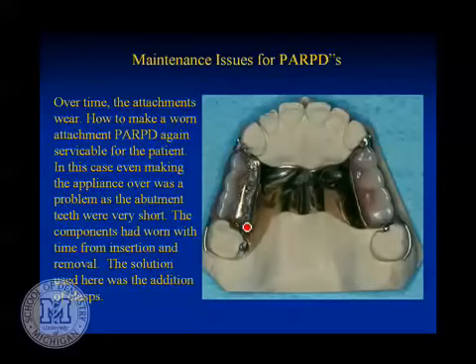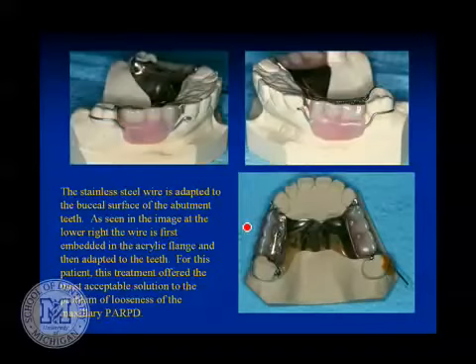Faced with all that, the patient said, gee, is there any way we can tighten this up? So what I did was take an impression, pour a cast up into the partial, and then bend some stainless steel wrought wire clasp to fit in here, trying to keep the clasp in the cuspid area as much toward the distal labial of the cuspid as I possibly could. Because again, one of the reasons for doing an attachment partial is to get away from clasps.